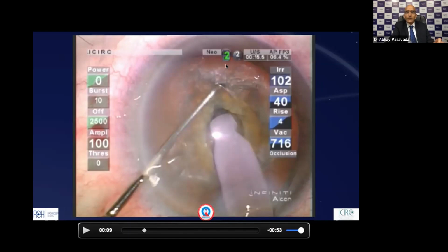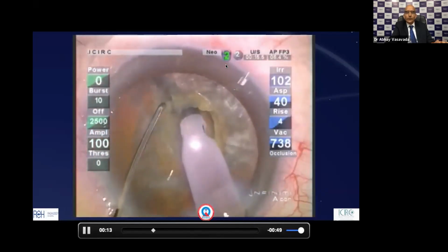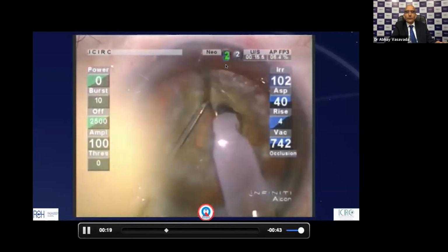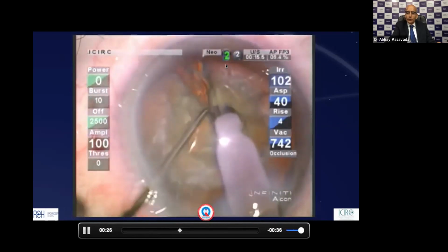My aim now is to initiate the crack by depressing the chopper vertically towards the optic nerve. The right hand remains still, and then I reposition the chopper into the depth of the crack and produce a lateral separation to create a total division, peripheral to central and anterior to posterior.